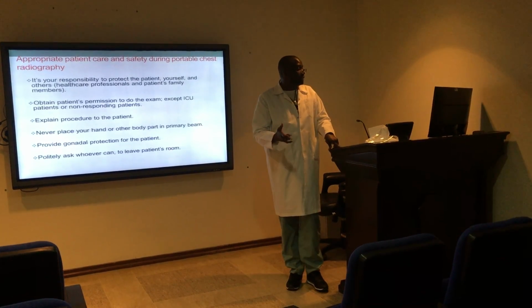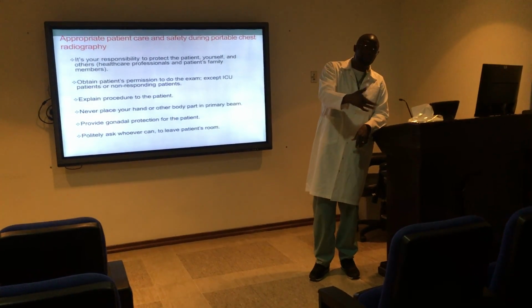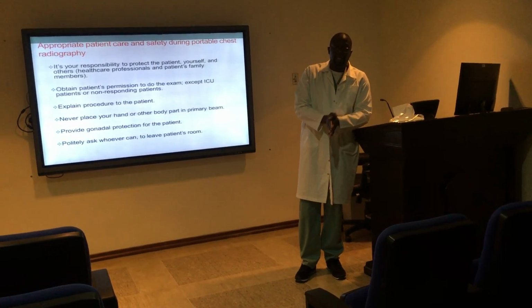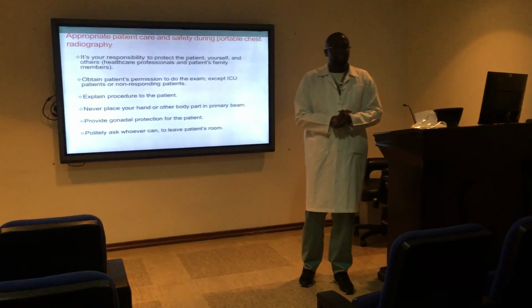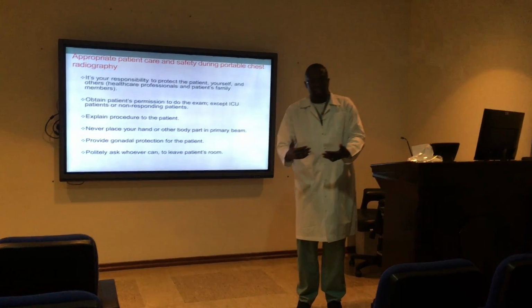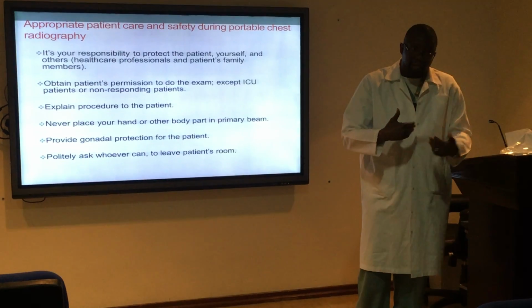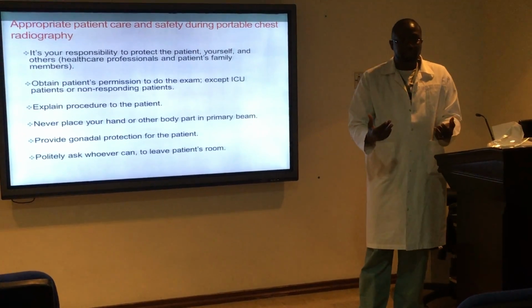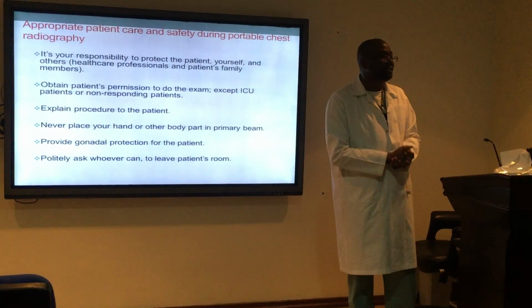The next step is to make sure you explain the exam to the patient, if the patient is one that is responding. Hey ma'am, sir, I'm going to be doing a chest x-ray for you. I will need you to sit up for me. I'm going to be putting this cassette behind you. Communication like that, gaining patient cooperation, makes your job a lot easier.